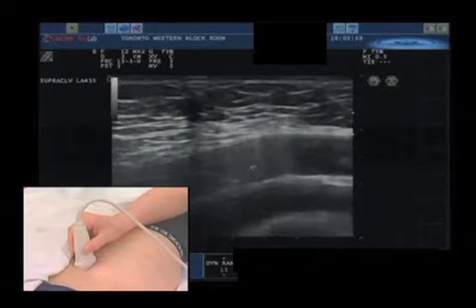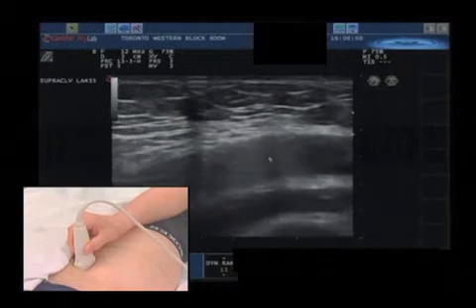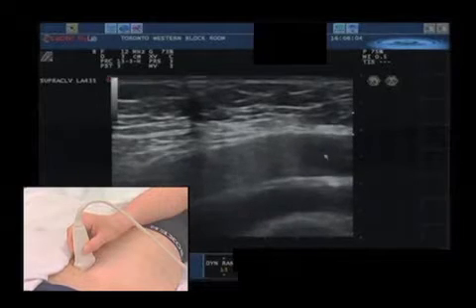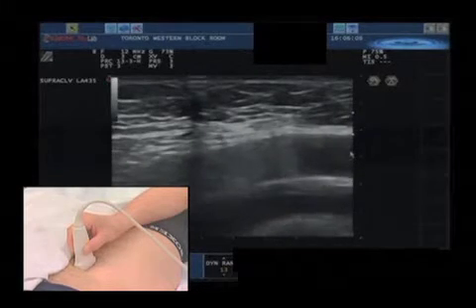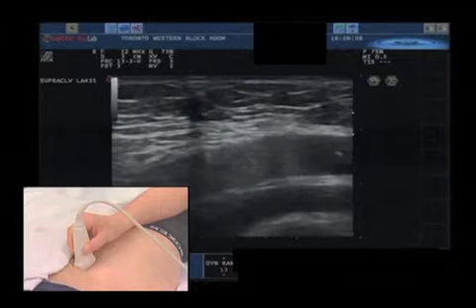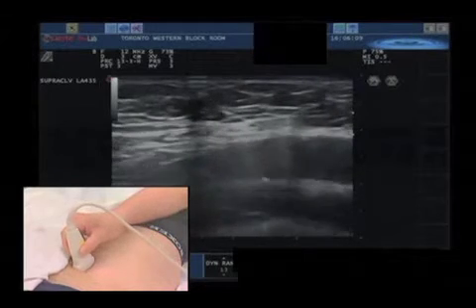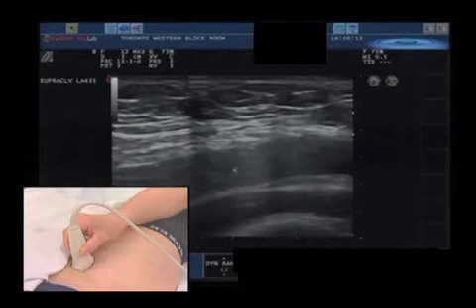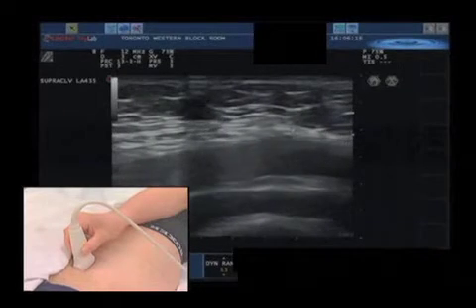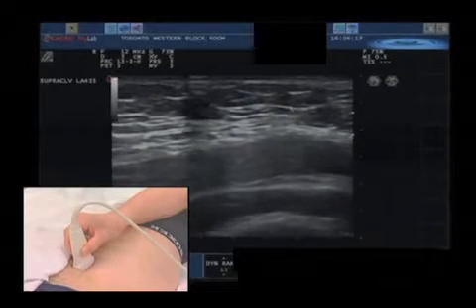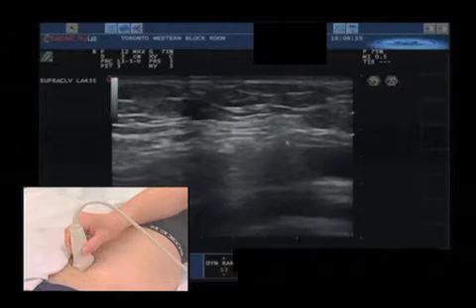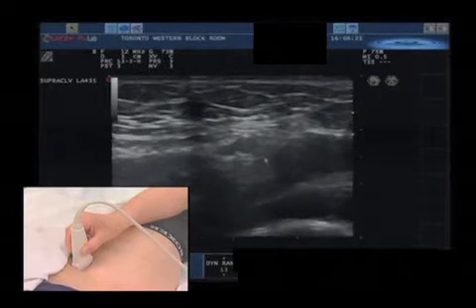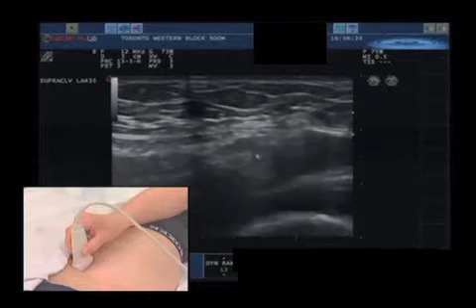We have the pulsating artery on the right-hand side of the screen — the femoral artery and iliac artery, the external iliac artery up there. Now we concentrate on the ventral aspect of that artery, and by moving the transducer more medially, we will see an important vessel that is pulsating here — that's the inferior epigastric artery.